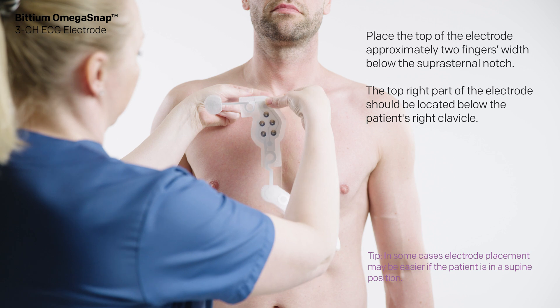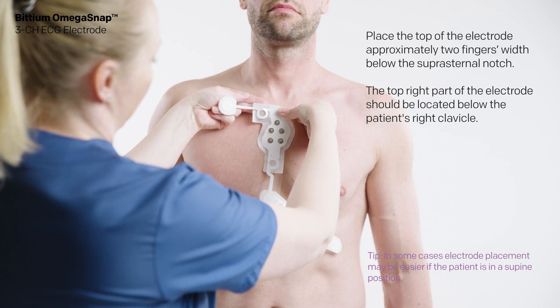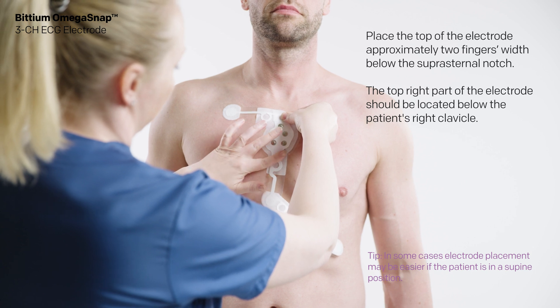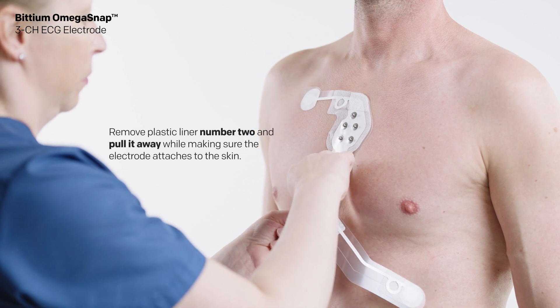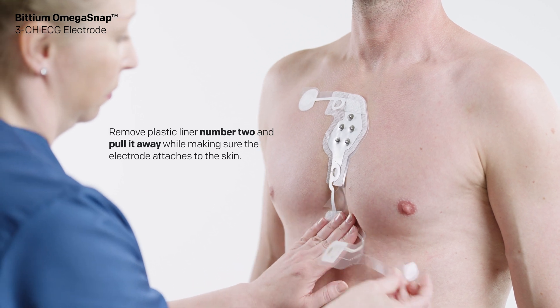Fix the electrode onto the skin. Place the top of the electrode approximately two fingers width below the suprasternal notch. The top right part of the electrode should be located below the patient's right clavicle. When the first part of the electrode is properly attached, remove the liner marked with number two and pull it away while making sure the electrode attaches to the skin.